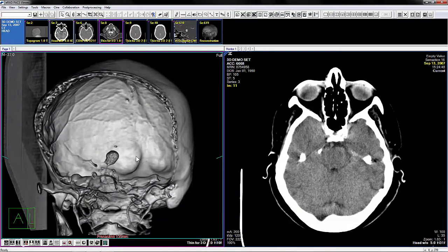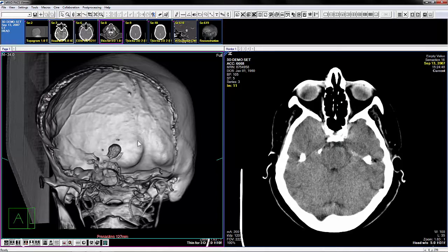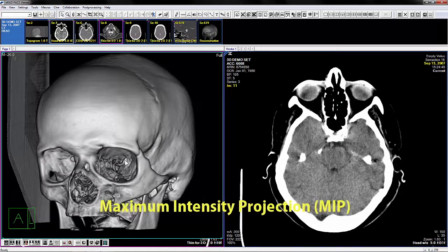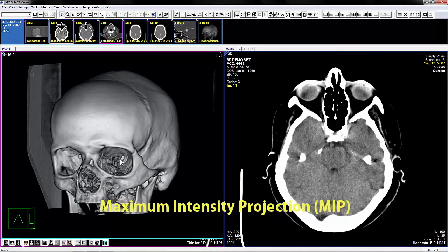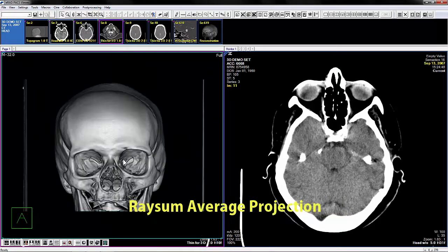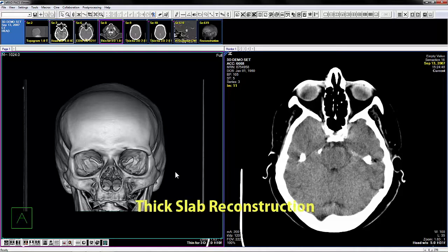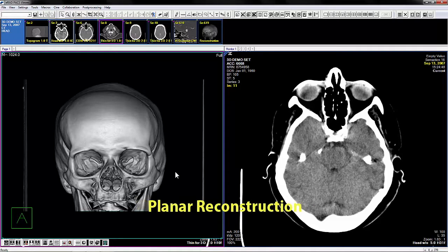Display orientation allows the user to control what alignment is applied to the volume, with axial, sagittal, and coronal presets. Projection modes include direct volume rendering, maximum intensity projection (otherwise known as MIP), and ray sum average projection. Reconstruction modes include full, thick slab, and planar.